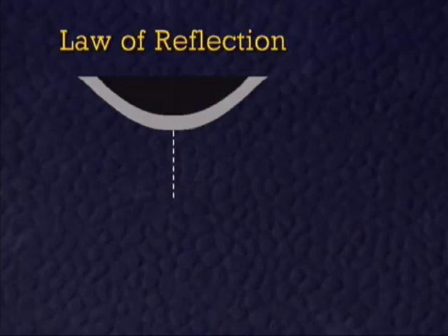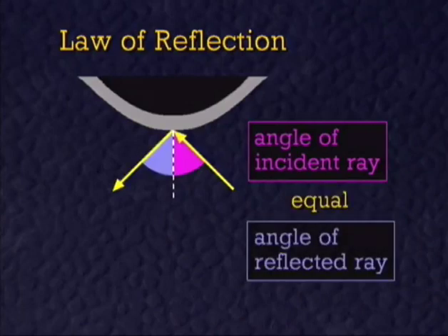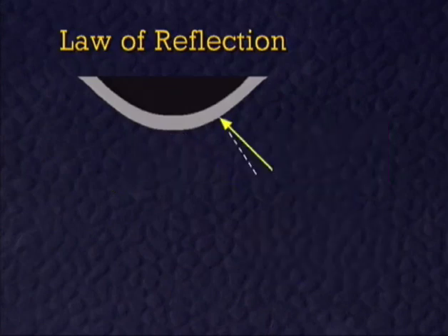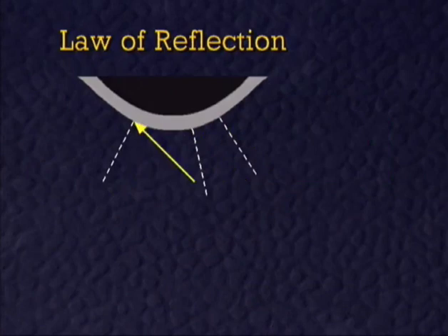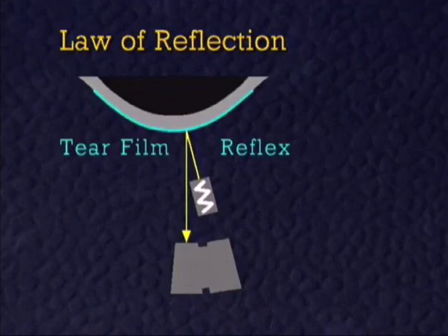According to the law of reflection, specular reflexes can be observed if the angle of the incident ray to the perpendicular is equal to the angle of the reflected ray. In clinical situations, however, the perpendicular is not known for every single point because the inclination of the observed surface varies. An illumination angle of nearly 0 degrees reflects the light rays almost automatically into one of the microscope lenses. Using this easy way, however, only the most superficial tear film reflex can be observed.